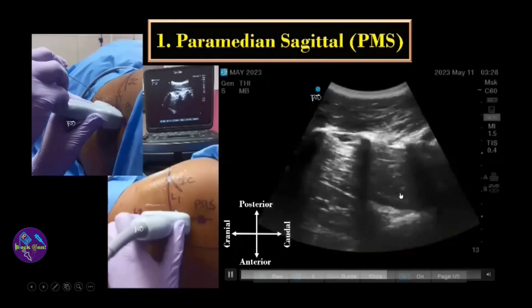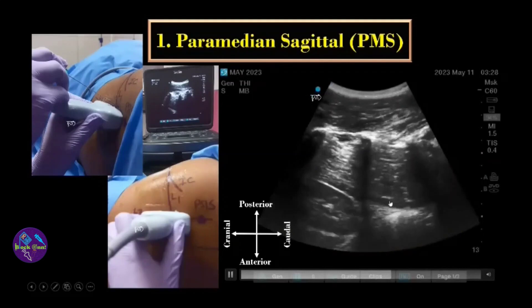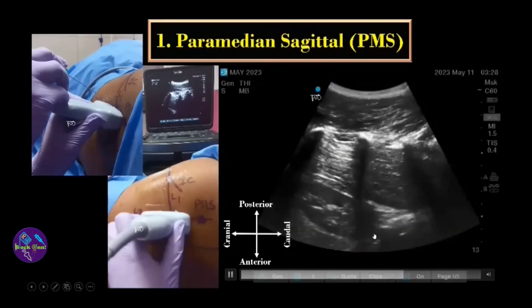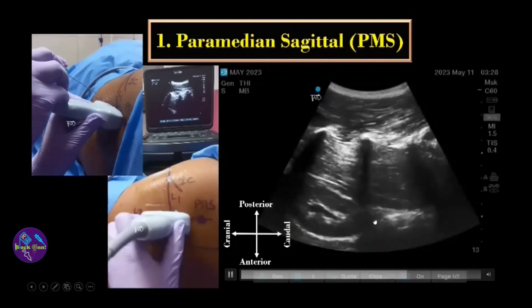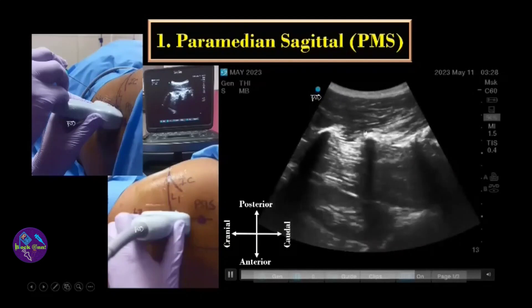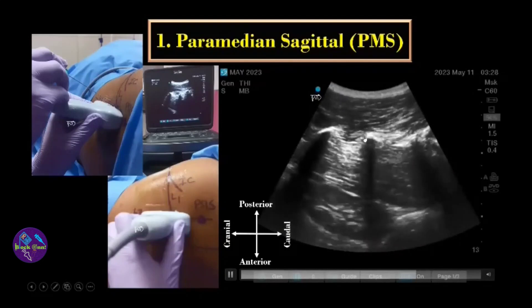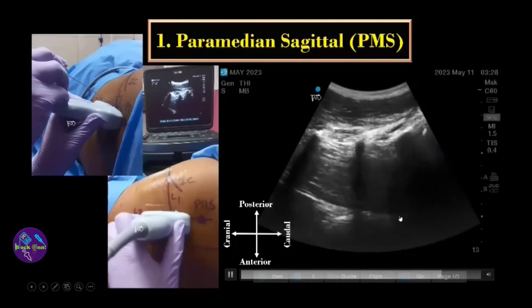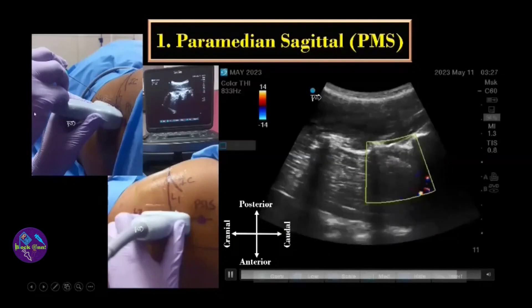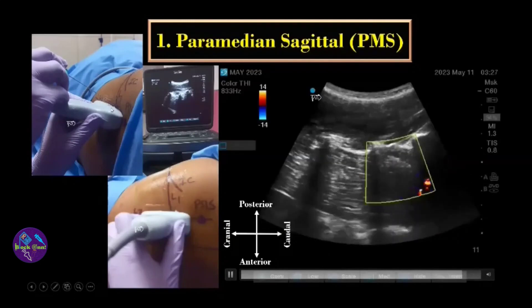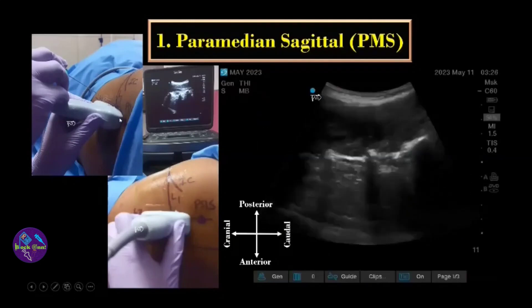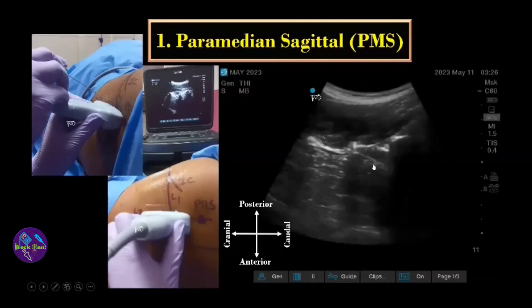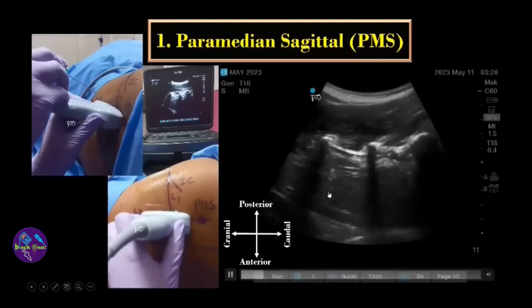If you go in the cranial direction, you may be able to see the lower pole of the kidney moving with respiration at the level of the L3 transverse process and above. Sometimes you might miss the transverse process; in that case, just tilt the probe in the medial direction so that you will get the transverse process or the trident view.